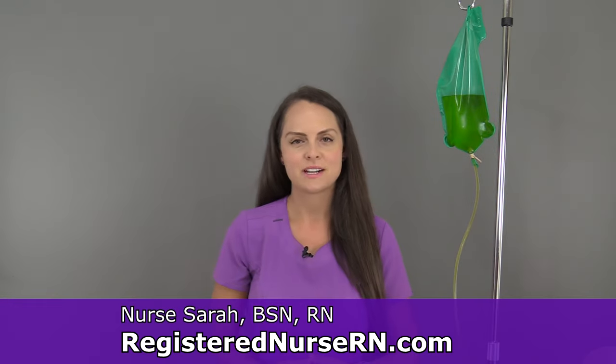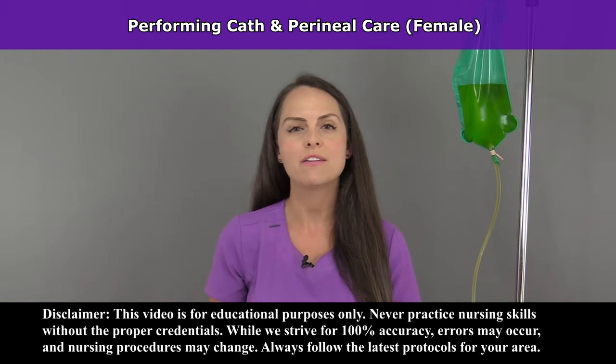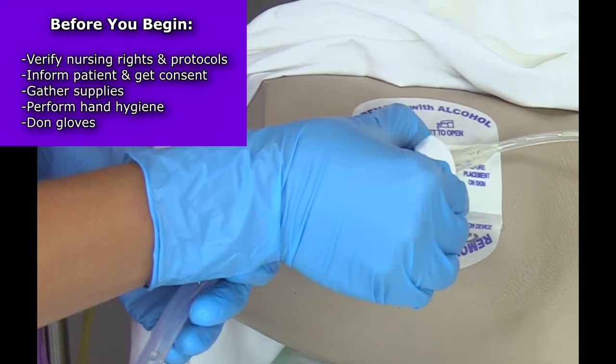Hey everyone, it's Nurse Sarah with RegisteredNurseRN.com, and in this video, I'm going to demonstrate how to provide cath care and Peri-Care to a female patient. So let's get started. So I've washed my hands and I've donned clean gloves.